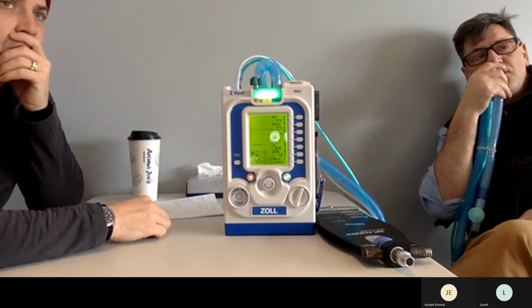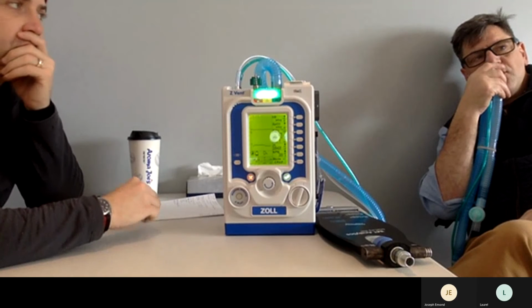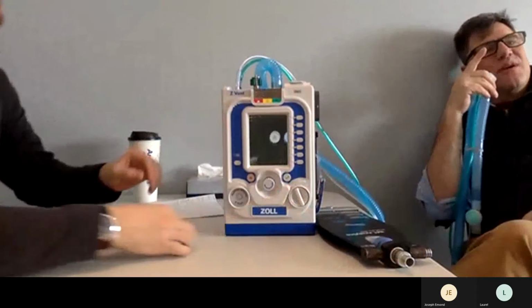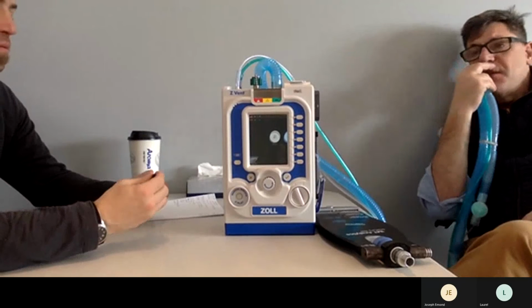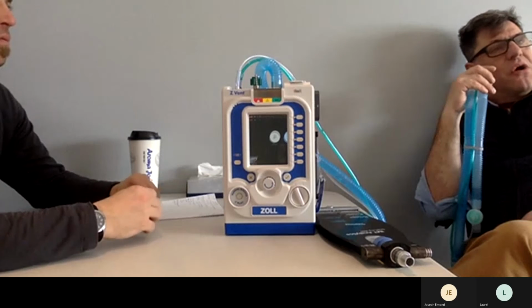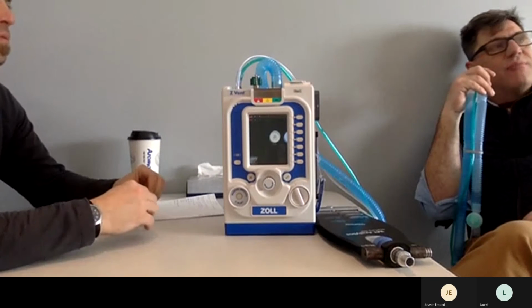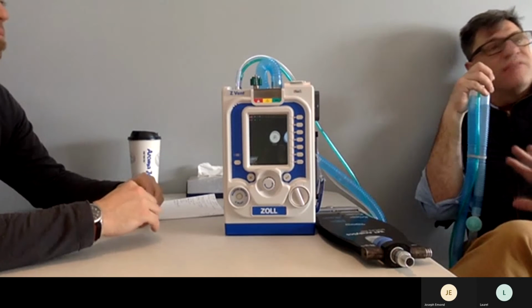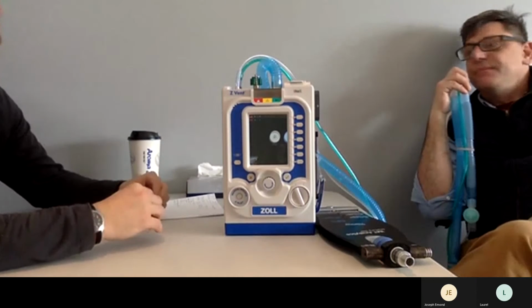Because those cannula setups, according to the literature for Zoll, are not accurate with liter flows over 5 liters per minute. Tangent, squirrel: ETCO2 is nothing more than an air gas meter. You read the gas coming out the nose. In this case, it's 35 to 45. All air gas meters start at 0 to room air. Then you give them to your patient. Do not put them on your patient and then turn them on. They calibrate quicker and more accurately. I'm talking about the LIFEPAK, the Philips, all of them. Plug it in the machine first, let it calibrate to 0, then give it to your patient.